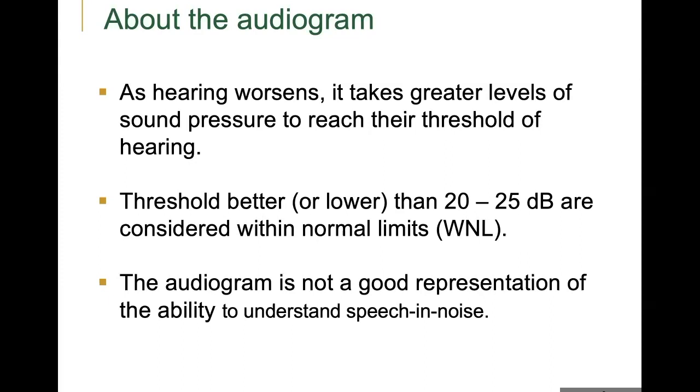Think about what we're doing in the booth and what someone does in the real world when it comes to their hearing. In the booth, we do a lot of things, of course. Sometimes we will present spondees, we'll do some word recognition testing, speech perception threshold testing. But the bulk of our testing is focused on pure tone audiometry. Play a tone, person indicates when they hear the tone, from 250 to 8,000 hertz. Now we're covering frequencies that make up the range of human speech, but we're assessing it using a pure tone.